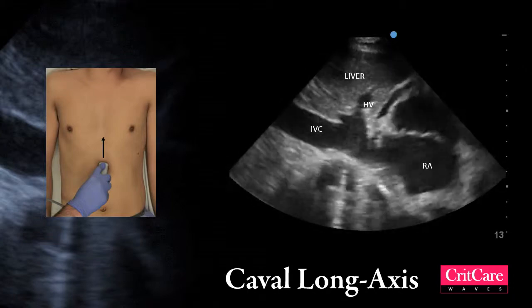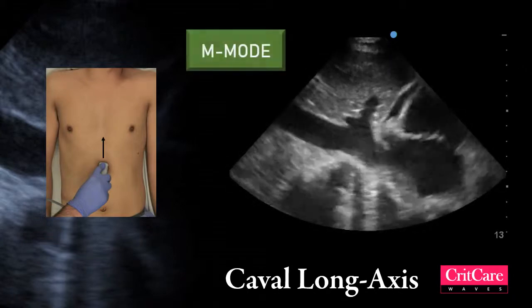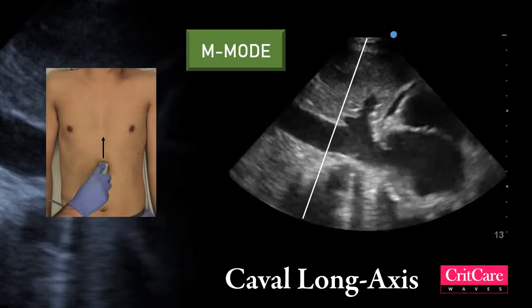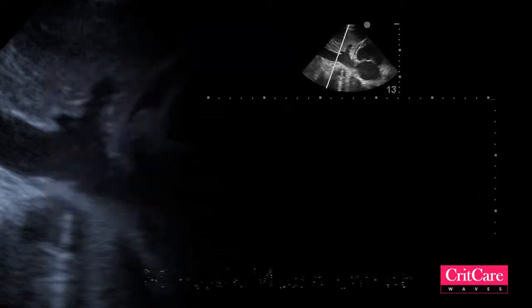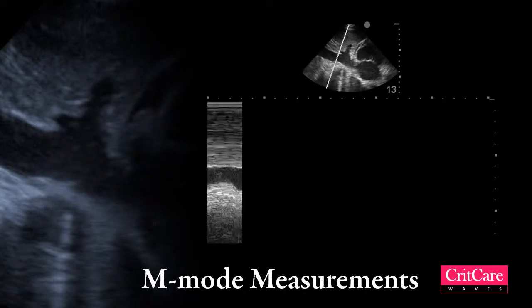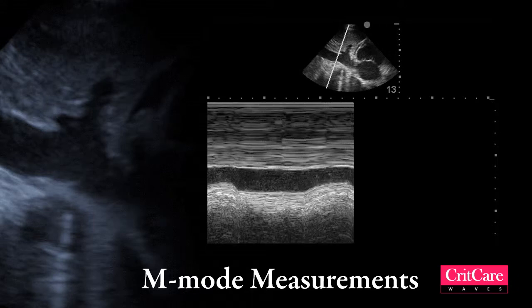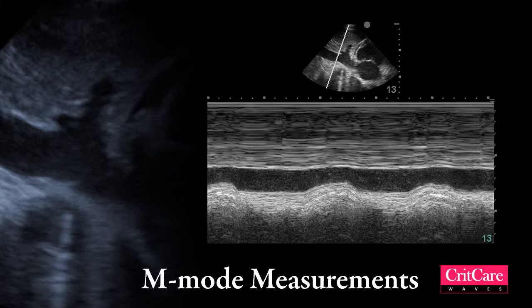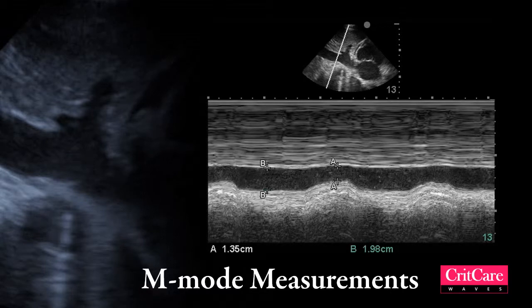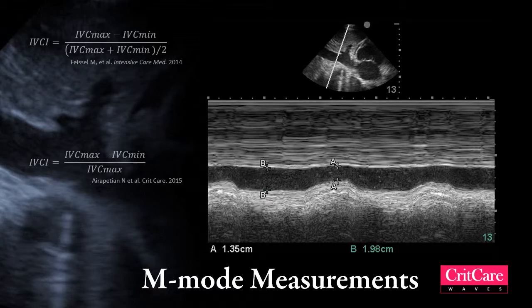You can use a function on the ultrasound called M-mode, which places a cursor through that area. What M-mode does is expand that out over time to show you the change in structures over that line. You can use this to measure the minimum and maximum diameter of your IVC.